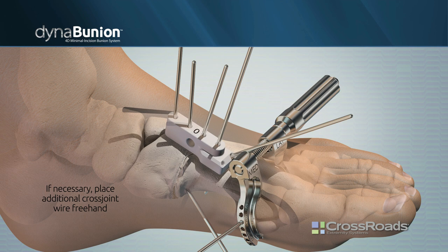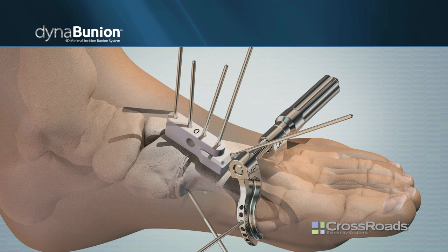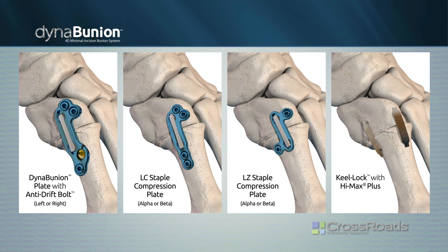Remove all four dorsal wires and slide the compressor block off the cross joint wires. Any crossroads fixation options, such as staple compression plates or staples, can be utilized to fixate the first TMT joint.